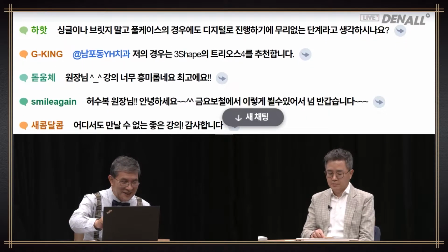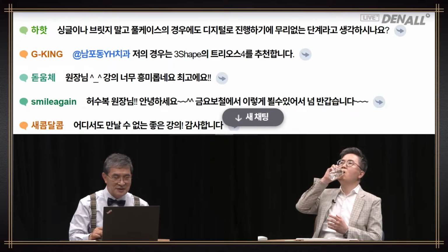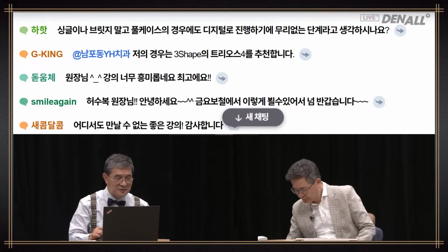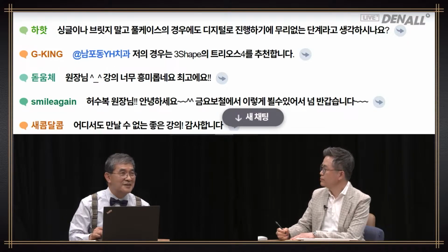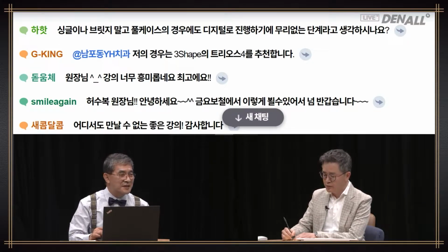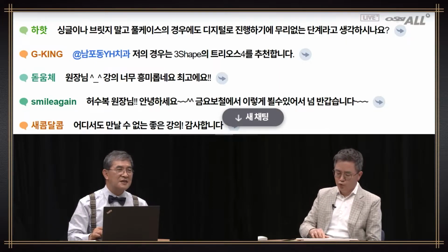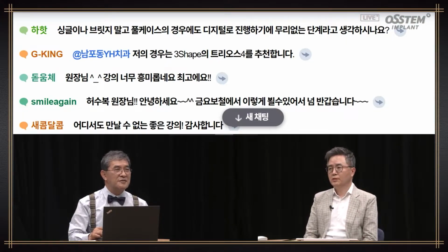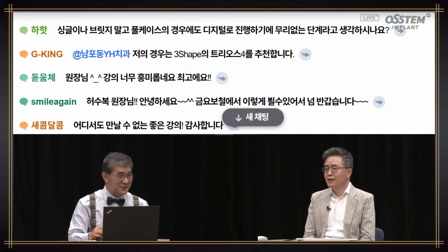That's true. ID Hahat: Do you think it is okay to use digital technology for full cases rather than single or bridge cases? Currently, with our technology, I think it's not going to be a problem. The question's over here. I think that's a limitation and question that we all have. Let alone scan, full mouth cases are very difficult. The same criteria applies.